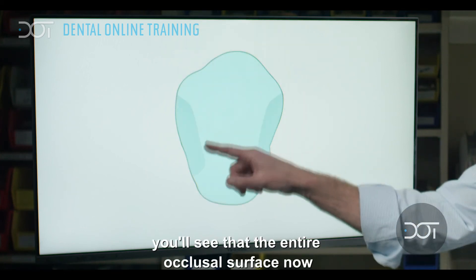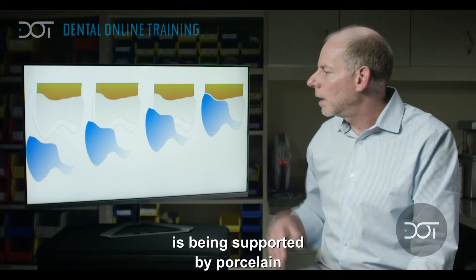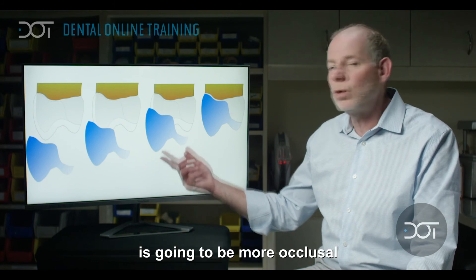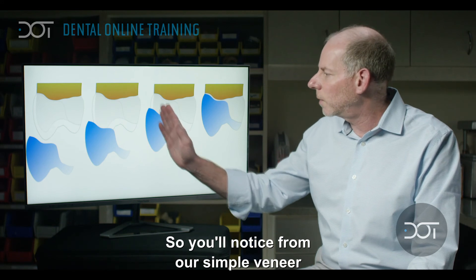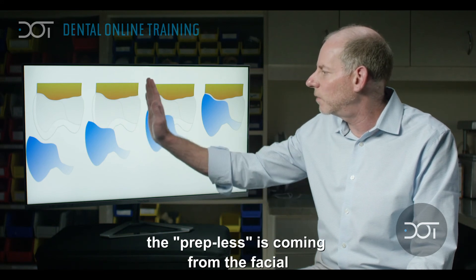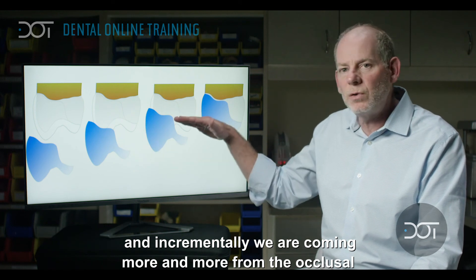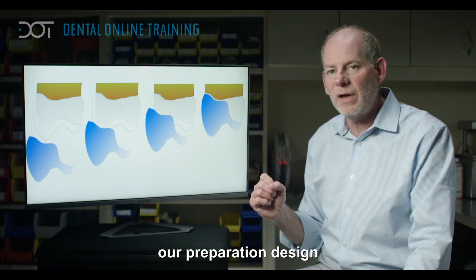Looking from an occlusal view, you'll see that the entire occlusal surface is now being supported by porcelain. The path of insertion is going to be more occlusal than what we saw from our previous restorations. From a simple veneer the prep path comes from the facial, and incrementally we come more and more from the occlusal as we add that occlusal portion into our preparation design.